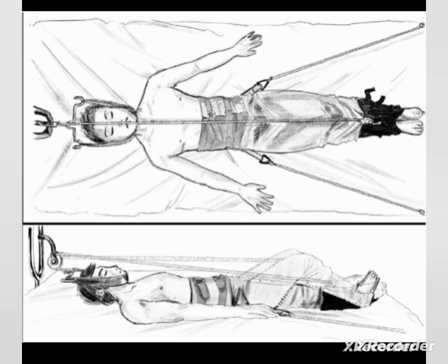This traction may cause pain or discomfort, and it can be removed for massage or skin care.